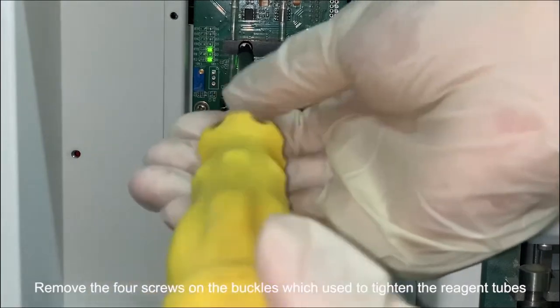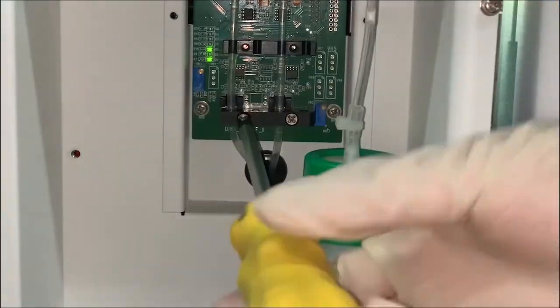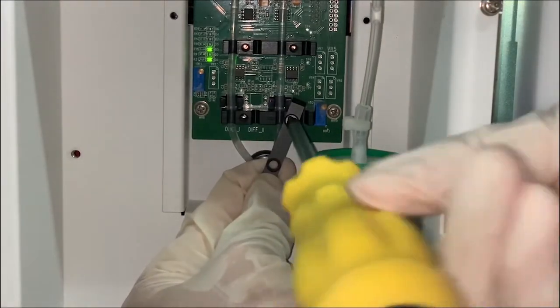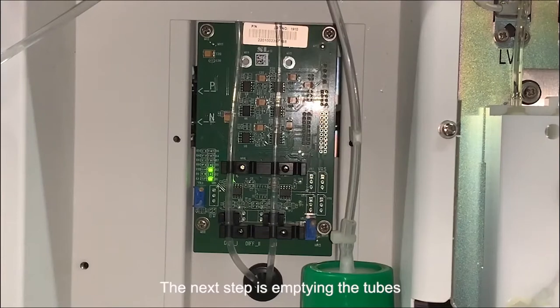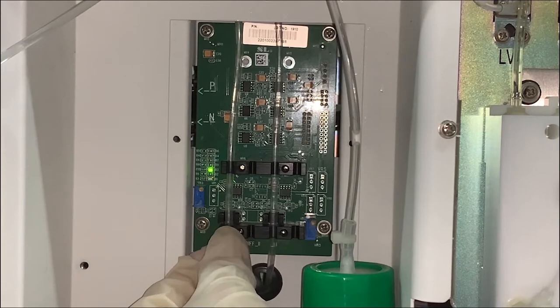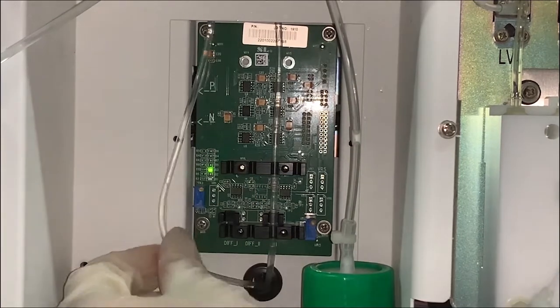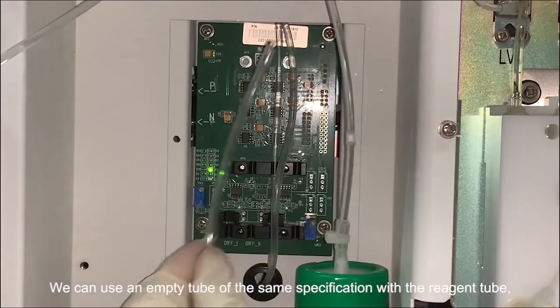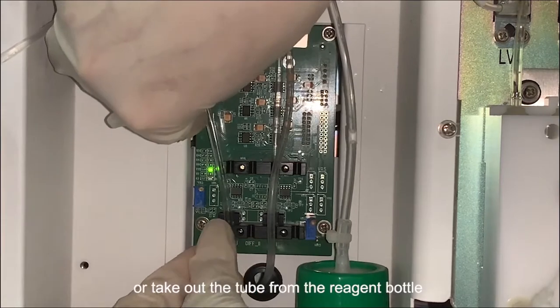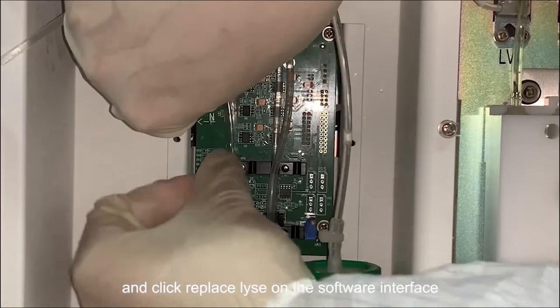Remove the four screws on the buckles which are used to tighten the reagent tubes. The next step is emptying the tubes. We can use an empty tube of the same specification as a reagent tube, or take out the tube from the reagent bottle and click 'Replace' on the software interface.